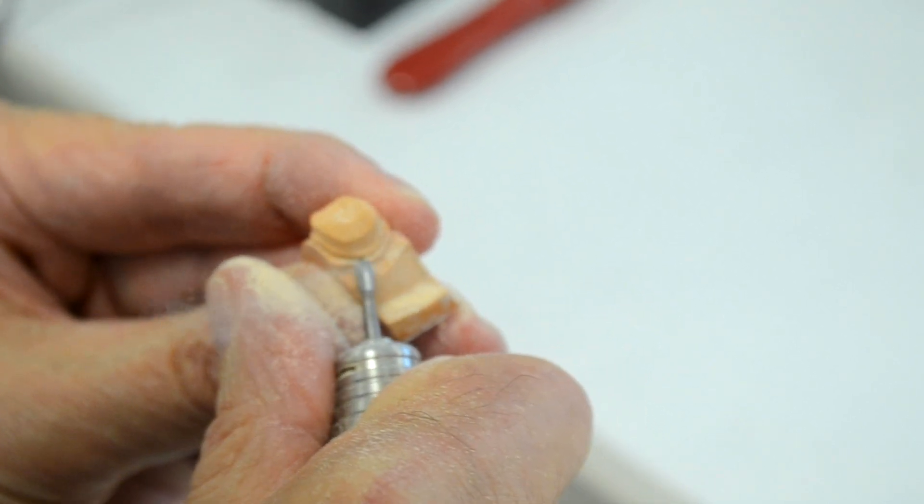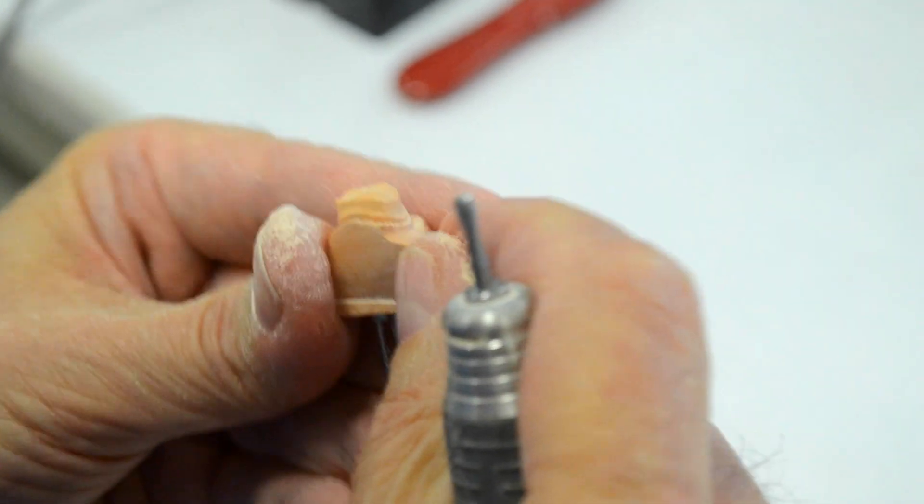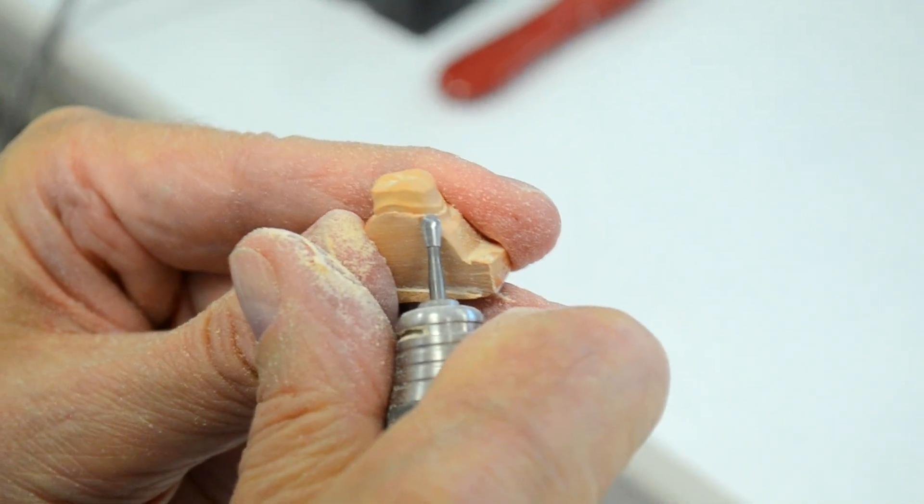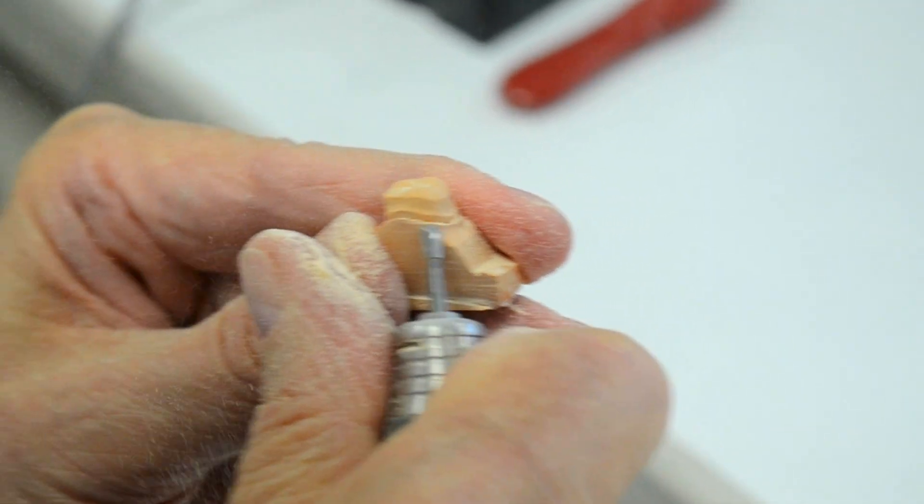A finger rest is essential in this case to prevent any inadvertent movement of the burr into the finish line.